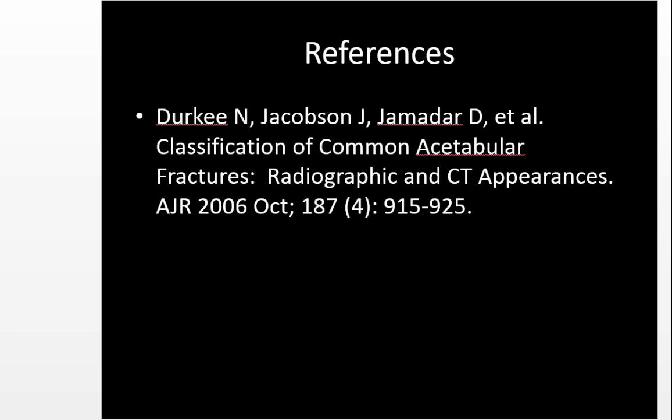This is a reference. The algorithm that I produced here is not my work. It's the work of these great musculoskeletal radiologists who published this in AJR back in 2006. You can read this article. This article is excellent, so please take a look at it.